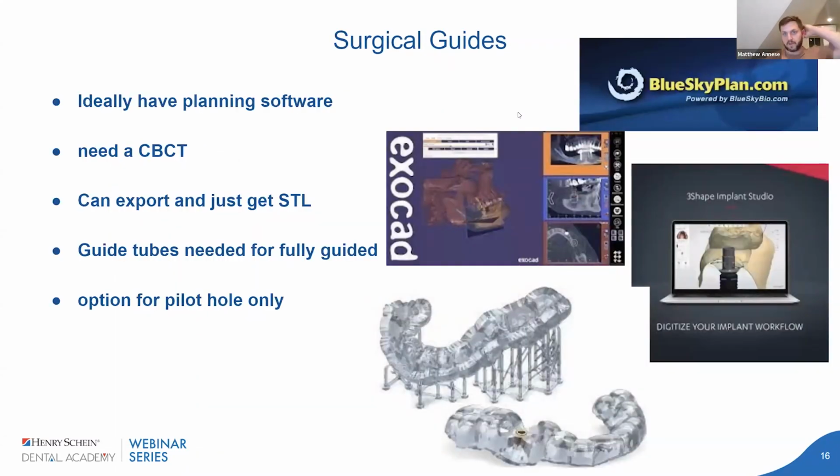Surgical guides. If you're doing implant placement, I'm a big proponent and advocate for surgical guides, especially in the beginning phases or difficult cases. There's minimal reasons why you shouldn't. Ideally, you need a planning software for this. If you have it, you should have Blue Sky Plan. Like I said, it's free. You just pay on the exports. We have the full exocad suite, so we have Exoplan as well. Pretty intuitive, pretty seamless, pretty straightforward.